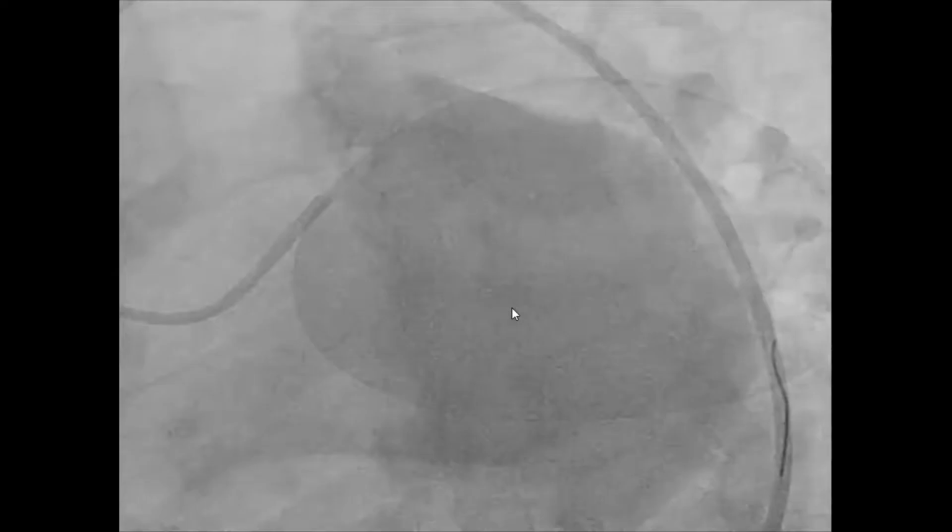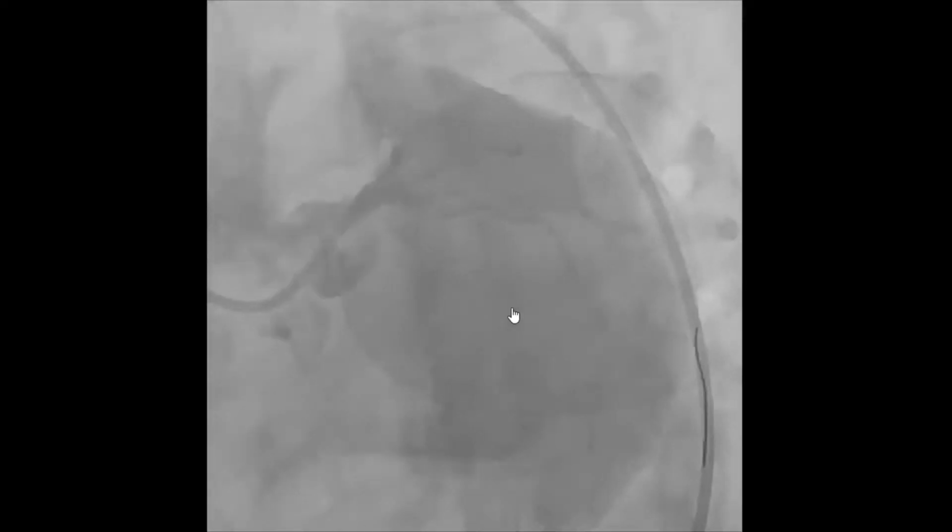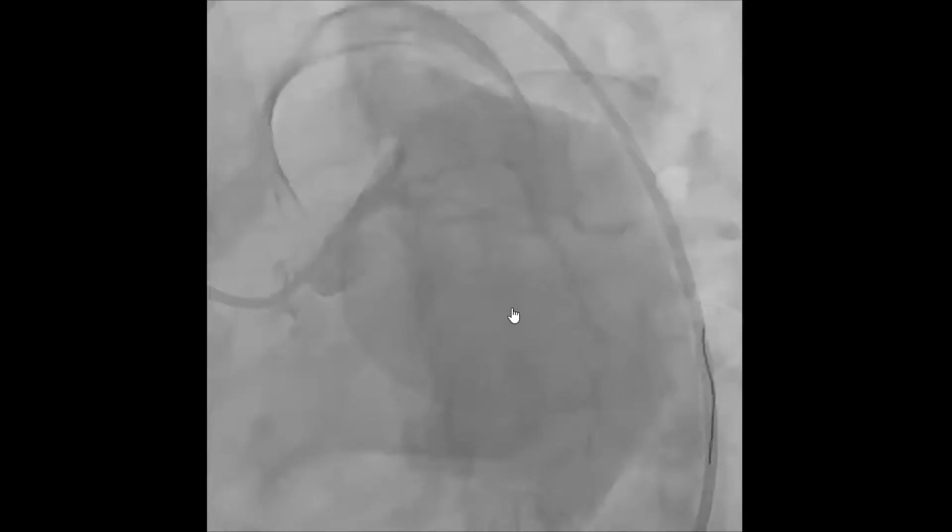Now, moving on to this other view. This is one of the patients who came to us in cardiogenic shock. As you can see, this is a spider, but all you see is just a left main stem, and the LAD is fully occluded. The circumflex is also occluded, apart from this little AV circ branch here. You also see this patch here, which is a defib patch. These are the defibrillator pads. He came as a major anterior STEMI, and normally these people have the defib pads on by the time they get into the Cath Lab.